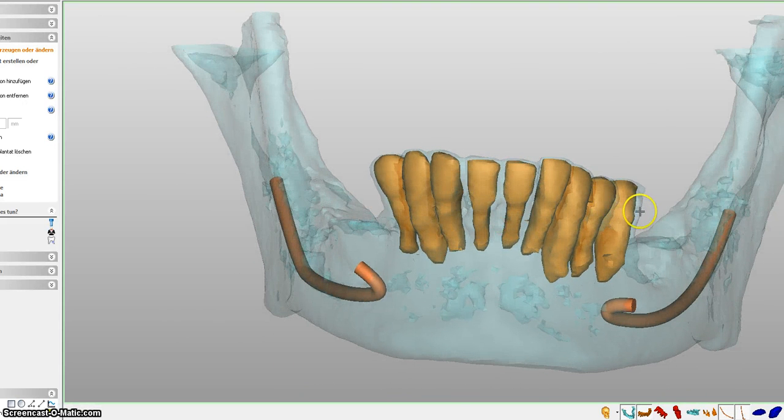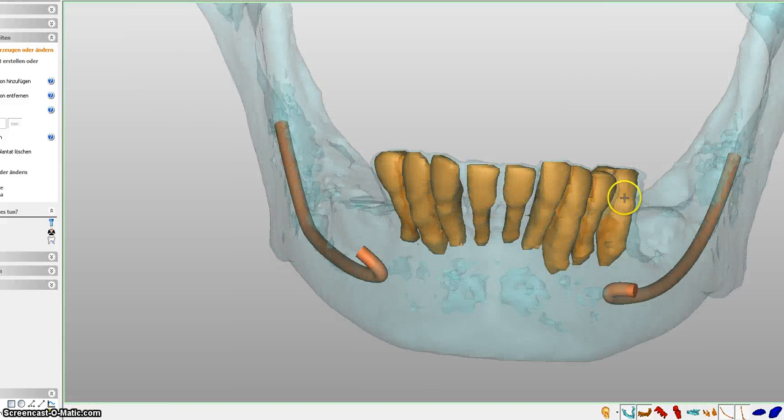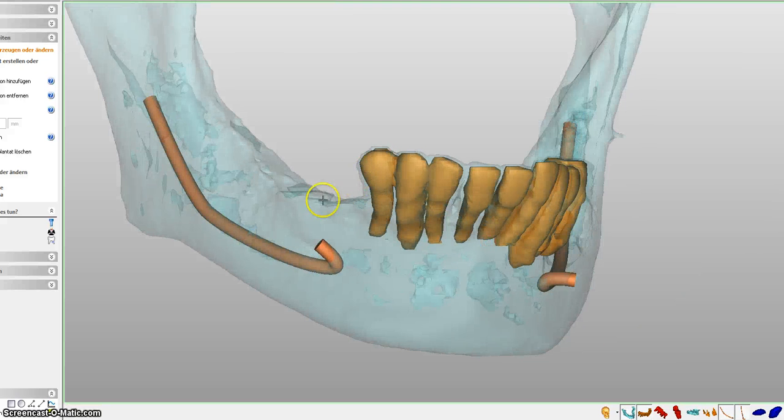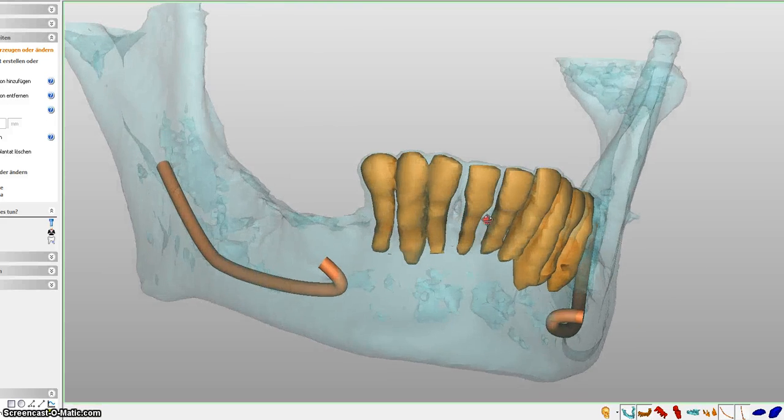One treatment plan suggests that we put crowns on top of all of your teeth in the lower jaw and make a cantilever towards the back. Cantilever means that all these teeth will be connected with crowns. What crowns are, Kata can tell you exactly. And then we will basically hang one tooth here connected to all the other crowns towards the front, which means you will have an extra tooth here with no additional surgery needed. That is one option: crowns on all of your teeth here and a cantilever towards the back to make a bit longer row of teeth.